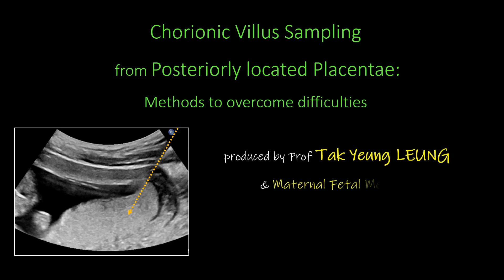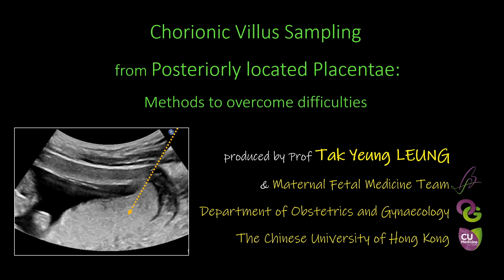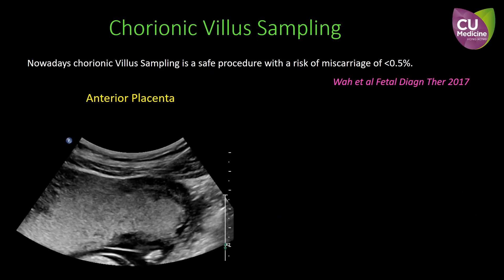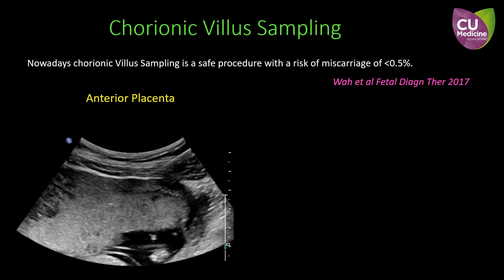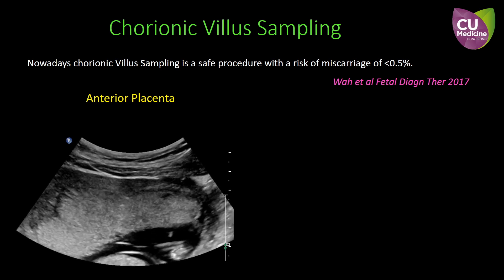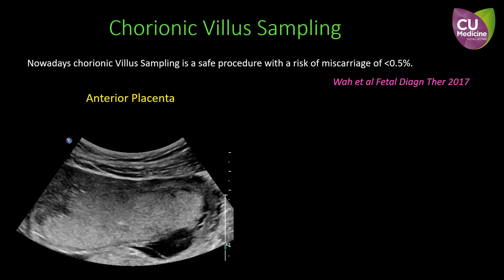This video demonstrates several methods to overcome the technical difficulties in sampling chorionic villus from posteriorly located placentae. Nowadays, chorionic villus sampling is a safe procedure. The procedure-related fetal loss is less than 0.5%. When the placenta is located at the anterior uterine wall, it is easily approachable.